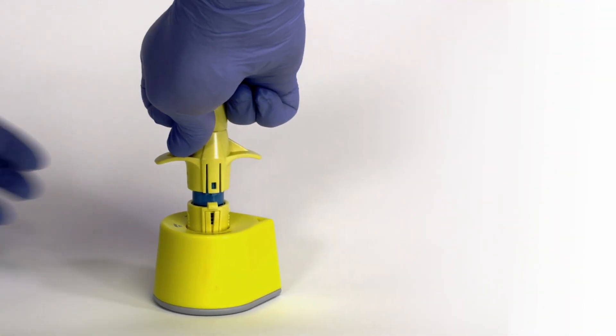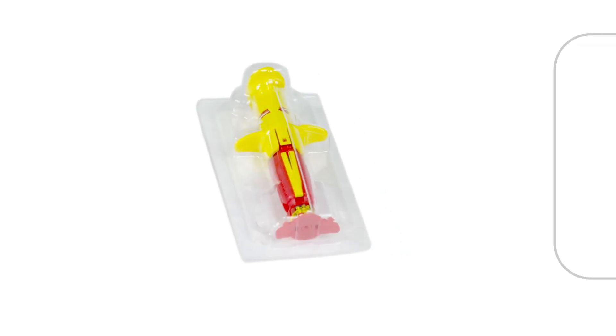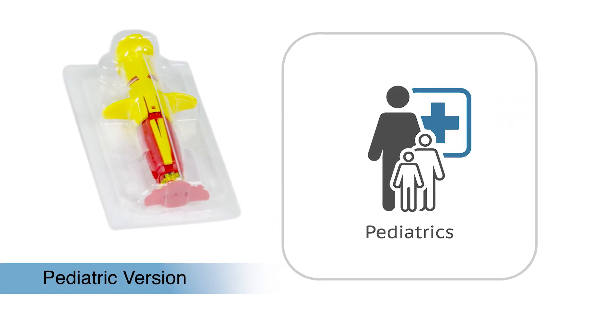The NEO sim can also be used on a mannequin if needed, but without leaving puncture holes behind. For the pediatric version, a Percy's training leg is recommended.